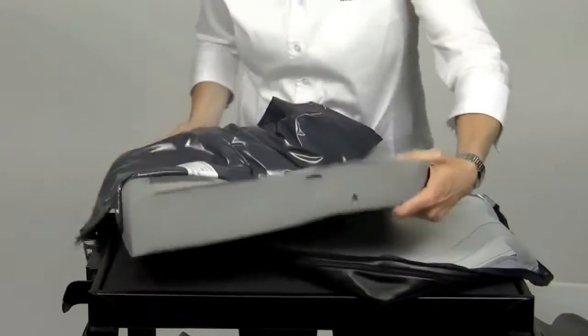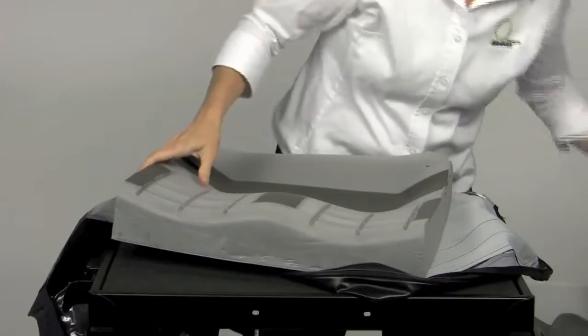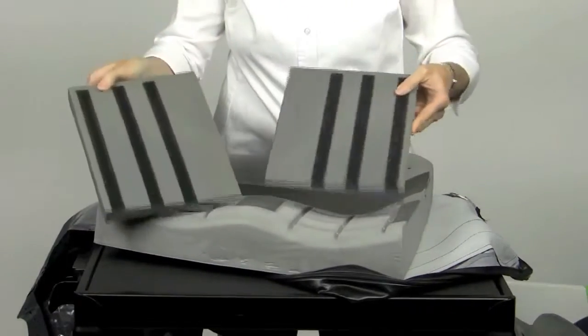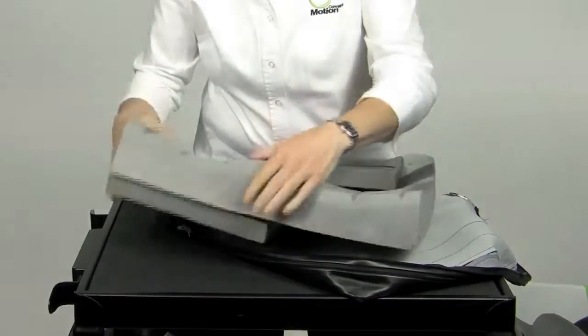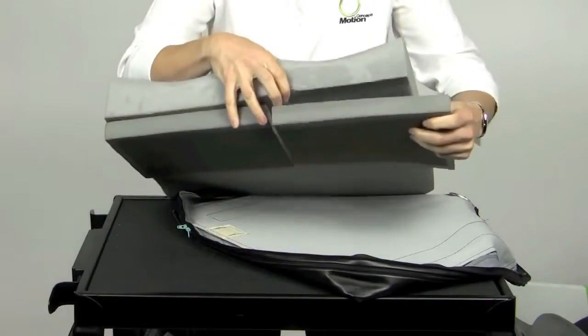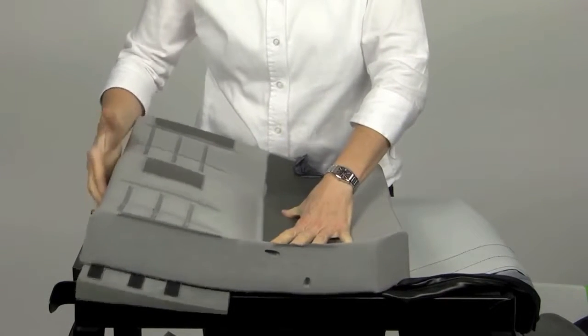The HR foam base is contoured and firm enough to provide stability but soft enough to provide comfort. The flexible base is able to accommodate positioning pieces attached to the underside. The anterior wedges allow the pelvis to sit level but incline the front of the cushion to prevent sliding, similar to an ergo seat.